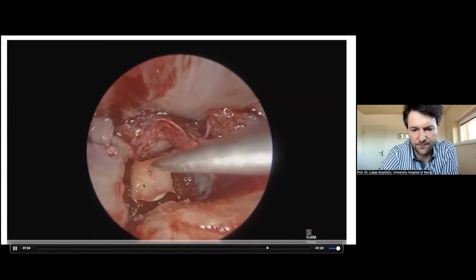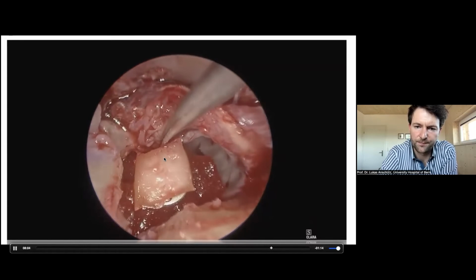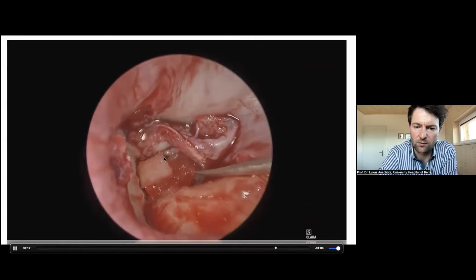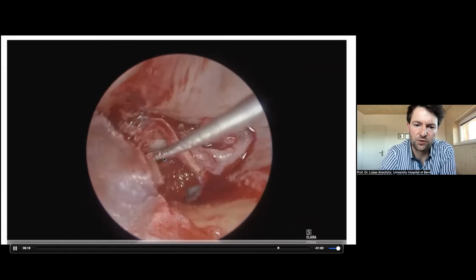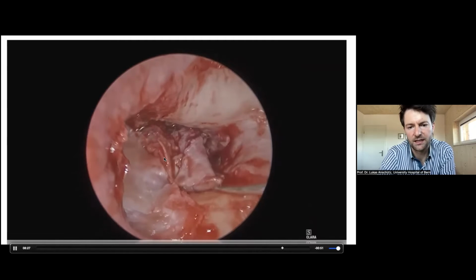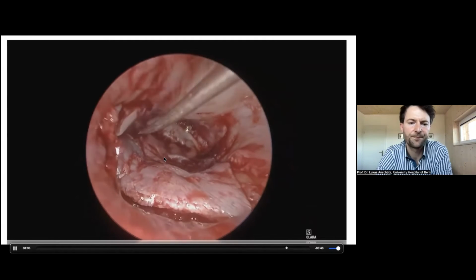Again, a little bit of gel foam and a piece of cartilage, which is in contact with the hammer to close up and cover the titanium prosthesis to avoid the extrusion. And a little last piece of gel foam, and then I put again some perichondrium to reinforce my reconstruction. And then I can put back the flap and close up the situation. You can see here the flap is really nice.